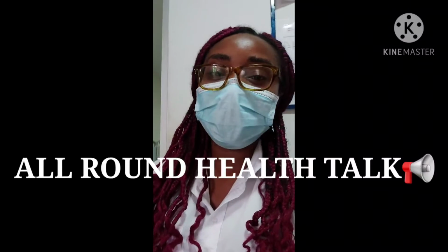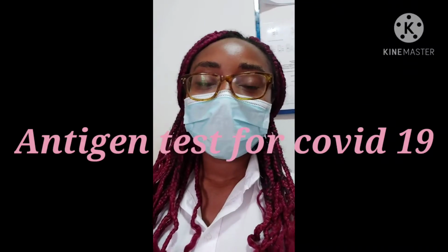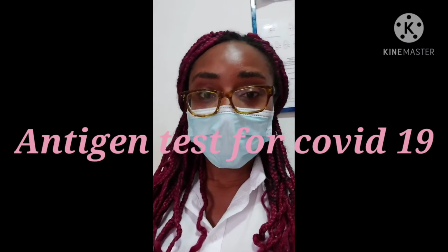Today we're going to be showing you a video on how to do the antigen COVID-19 test. Obviously, we all know that there is a rapid test which we have shown in one of our videos, but there's also the antigen test, and then there's the PCR which we've also talked about.